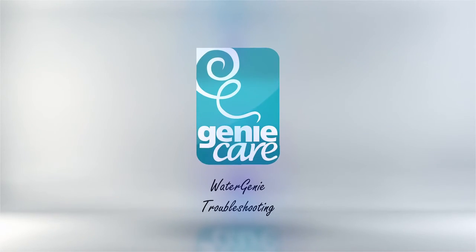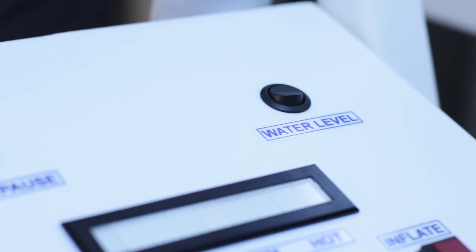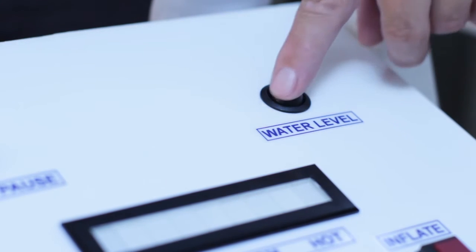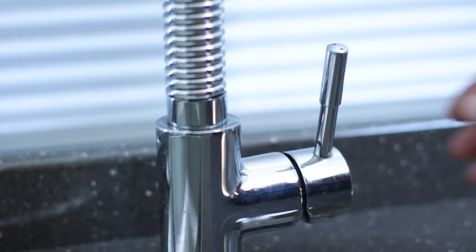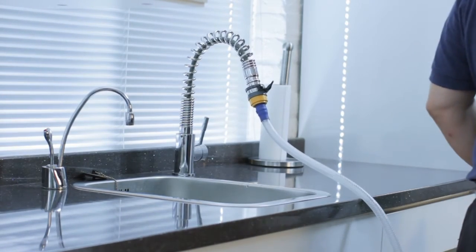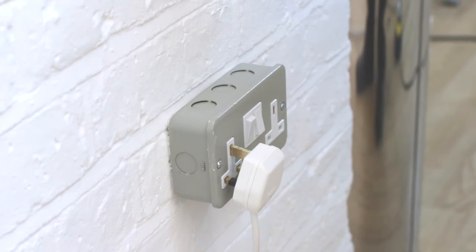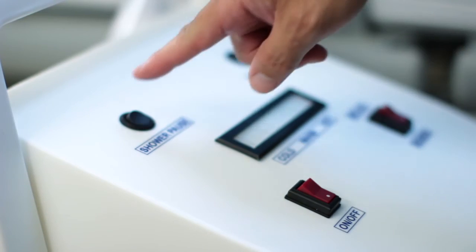Troubleshooting. During filling, the low level alarm may sometimes be triggered, sounding an additional constant note. This is due to low water level and will stop once the water covers the sensor. If the unit does not work at all, please ensure the plug is fully inserted into the socket, or try another socket.